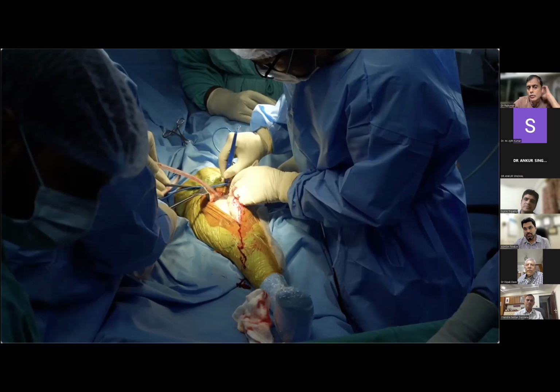But I think you are using regularly these dynamic spacers, and you have got some custom-made good way of doing it. Yeah, the advantage we have is that we can increase the poly thickness. So we just measure the gap, flexion gap, and according to the cement spacer thickness, we can increase and adjust on table. So we just get a better stability. So in a post infection TKR, how many grams of cement do you totally use for a custom-made dynamic spacer?